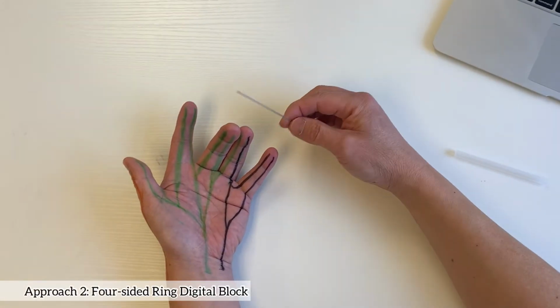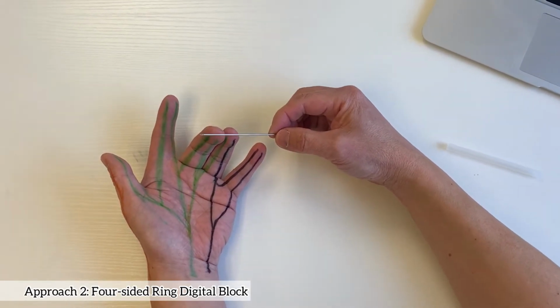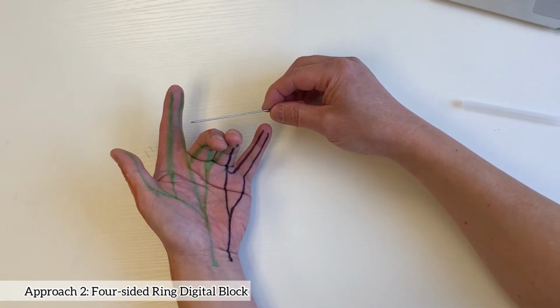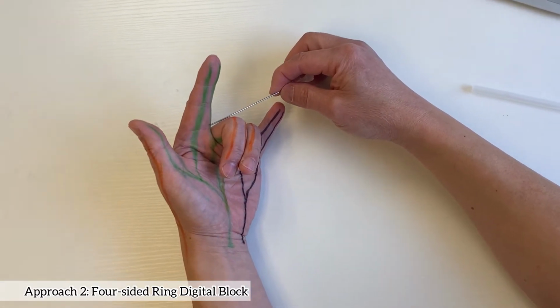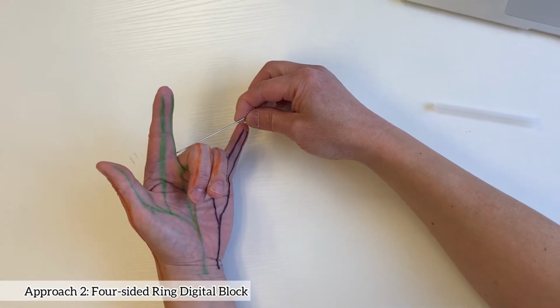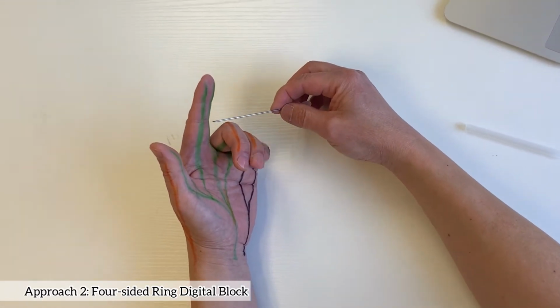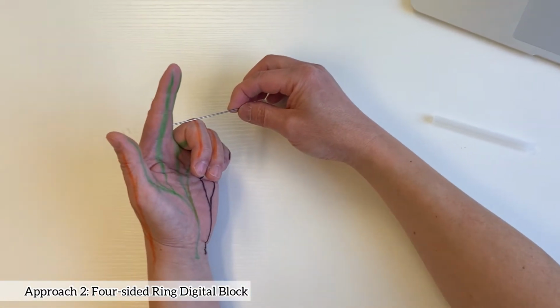So now let's talk about 4-sided digital block. It's also called ring block. It's an extension of the 3-sided block. After the third injection is performed, insert the needle at the lateral aspect of the digit on the volar side, advance the needle medially, and inject local anesthetic. But this technique is less favored because of potential ischemic complications.